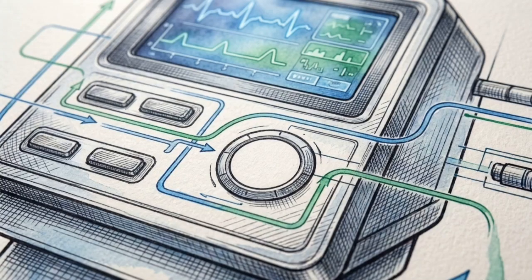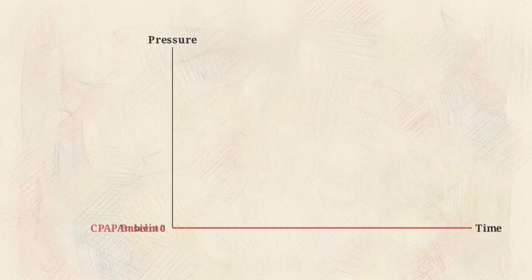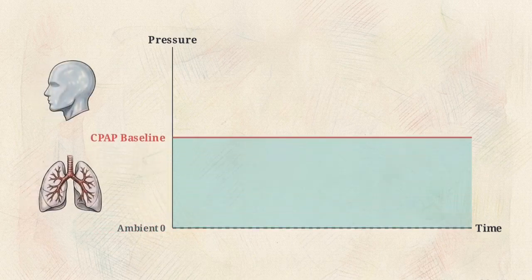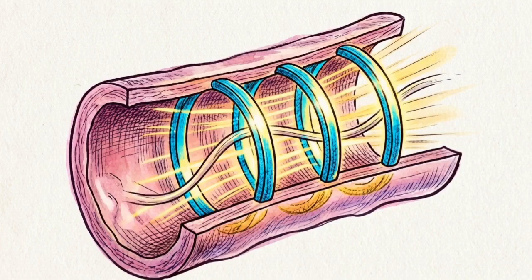When we ask what is controlled, we find the ventilator provides zero mandatory breaths and does not dictate volume or peak inspiratory pressure. What the machine actually does is raise the baseline floor. It maintains a constant positive pressure throughout the entire spontaneous breathing cycle to keep the airways propped open. CPAP is not a breath delivery system. It acts as an internal structural splint for a patient who is already doing the respiratory work.